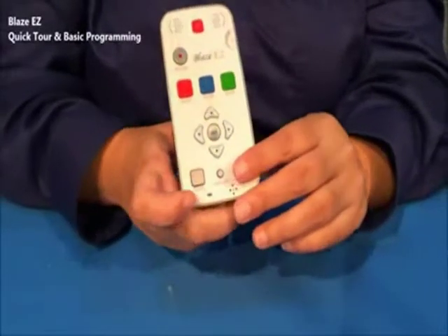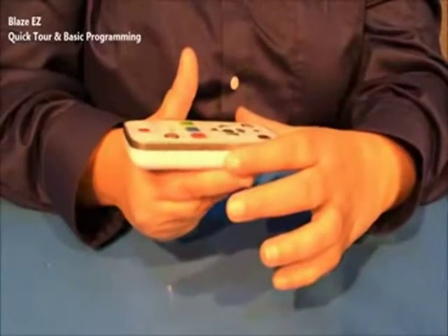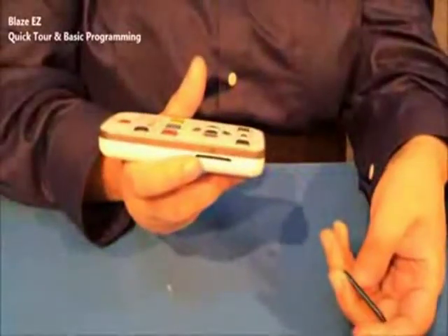If we move around to the left side of the unit, you have the SD card slot, and right now there's an SD card in it. I'll remove that, and you can see that there's a nice little slot, and I will again reinsert the SD card.